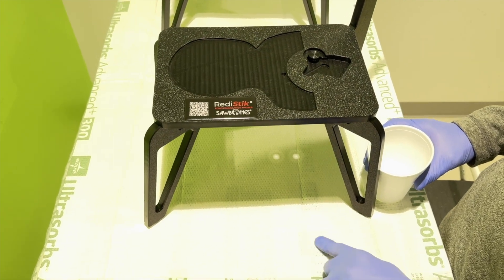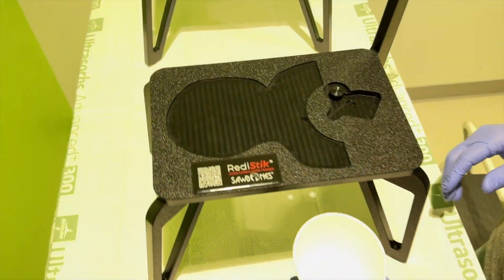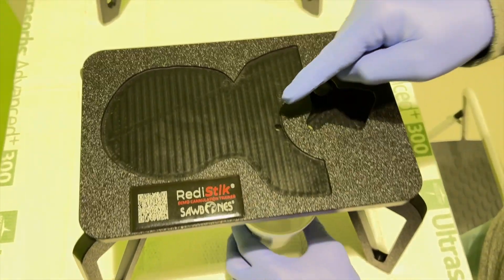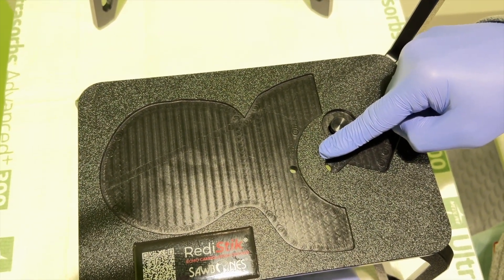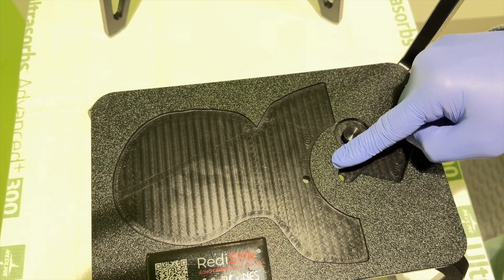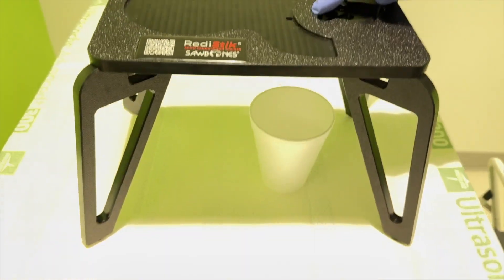We recommend using a chucks under the trainer, and you can also put a cup under it. We have two holes in each base, and once you cut into the vessels, any bleeding will leak through those holes and you can collect it in the cup if you want.